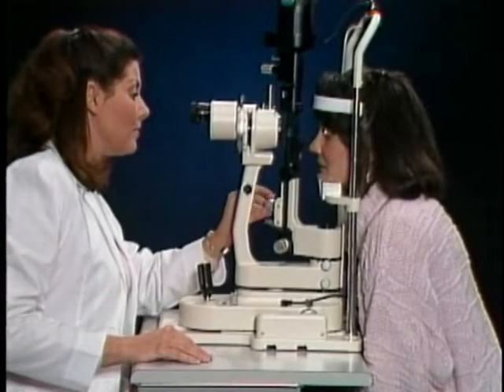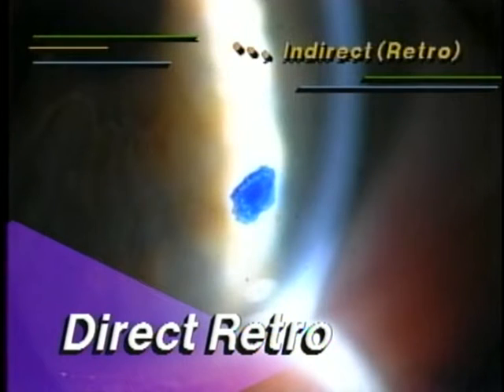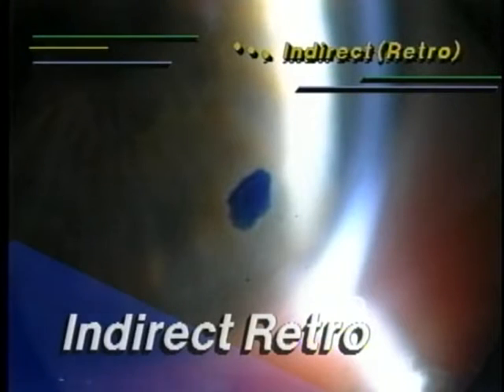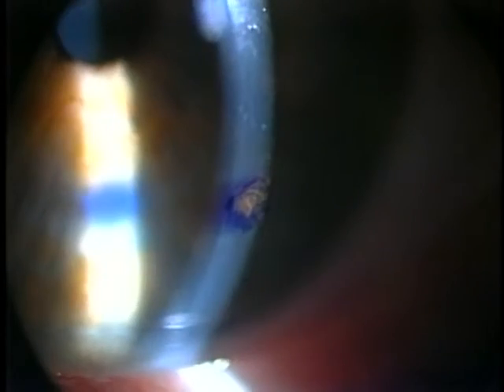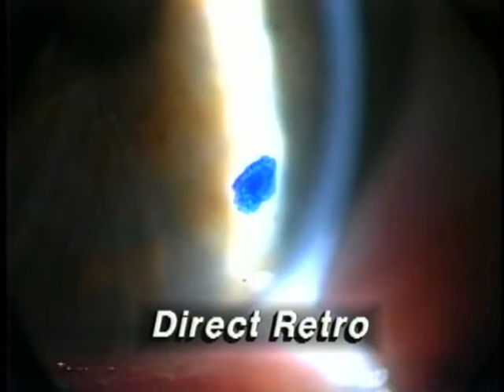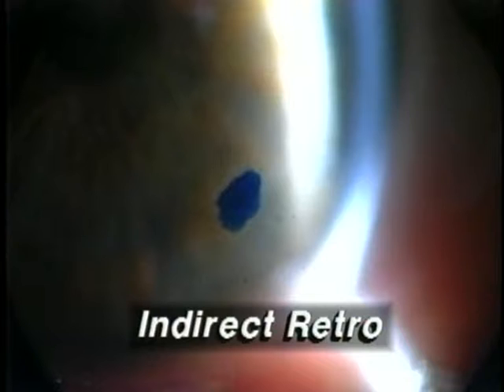Our next segment presents the second category of illuminations. Indirect or retro-illuminations are formed by rotating the mirror out of click-stop, so the focal points of the illumination and magnification systems are no longer coincident. Retro-illuminations allow a semi-transparent structure to be viewed against an illuminated background and are useful for determining the density and boundaries of lesion types found in the cornea. Starting with the parallelopiped, the lesion is viewed by direct illumination. The slit beam is moved out of click-stop until the light reflecting off the iris is directly behind the lesion — this is called direct retro-illumination.